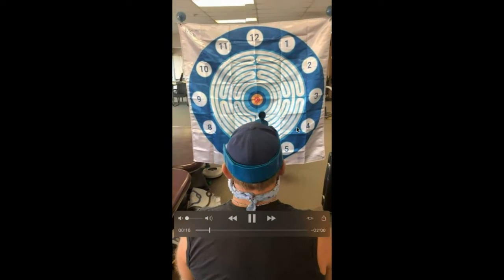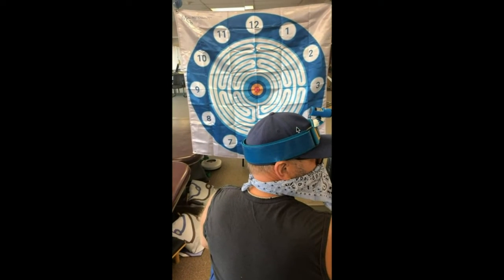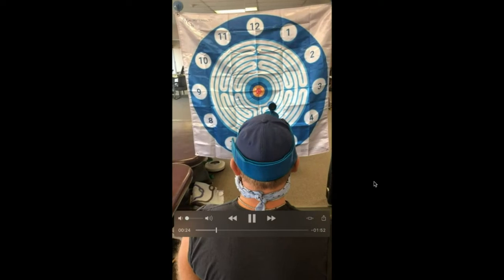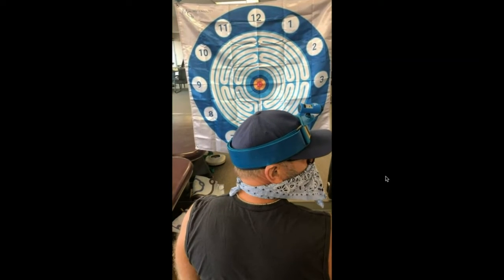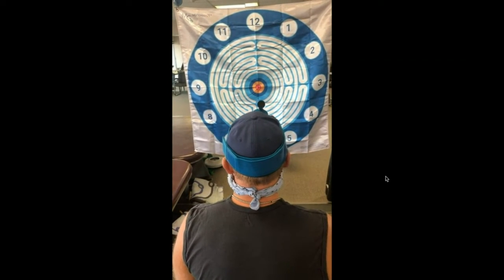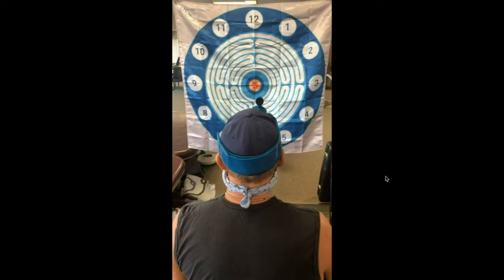He's going to perform a repetition of eyes open. You can cue him to not turn his torso, of course, or put a laser on the torso. And then we can do eyes closed. Let's see if I can get this. And then he's going to come back to where he thinks the center of the target is, and let him kind of work on it for a second, and then determine if they're in or out.